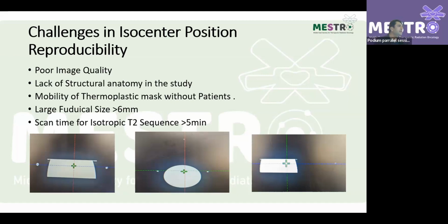And another thing, the scanning time for his MR was more than 5 minutes. It is too much for the patient.